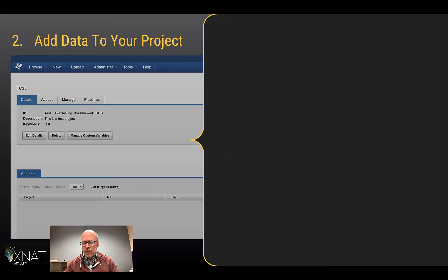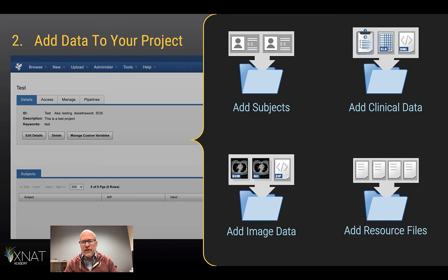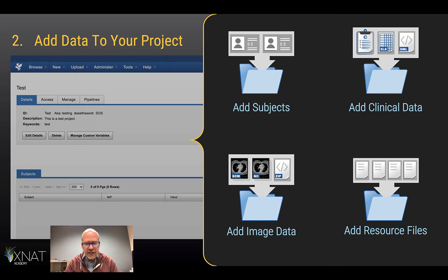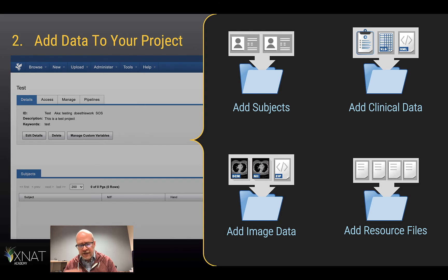Of course, you can add data to your project. You can add subjects, clinical data in various forms, and image data in whatever form it comes in. You can add pretty much any other file type as a resource all up and down your project. In short, XNAT is hungry for your data.